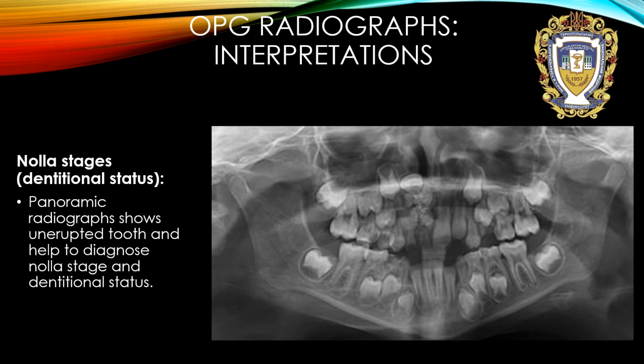First, we need to describe what dentitional status, Nolla stages. Panoramic radiograph shows unerupted tooth and helps to diagnose Nolla stage and dentitional status.